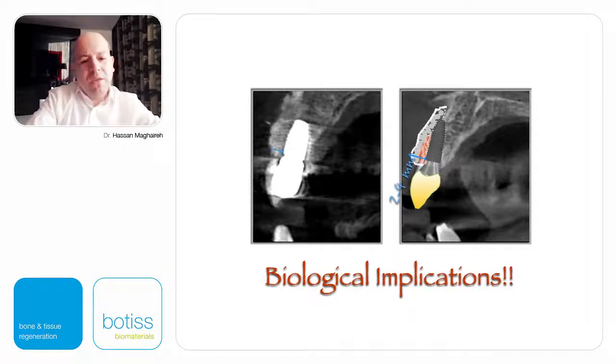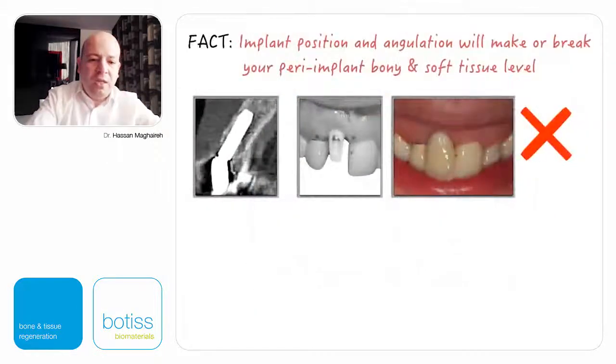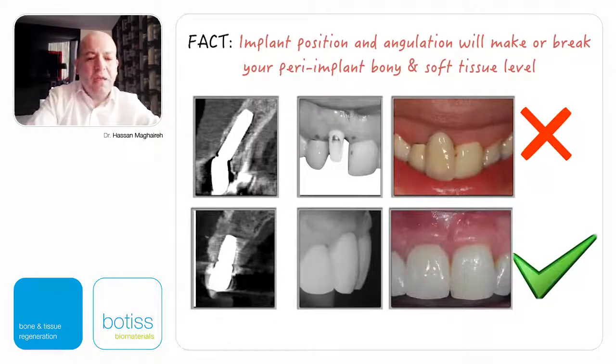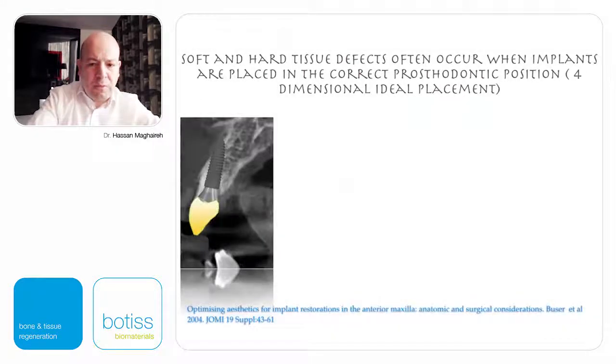And this is what we're talking about. When you look post-op, I still have my desired labial bone, guided bone regeneration, giving me the stability I want. Placing the implant in the wrong position will make it hard for the bone to stay, and will make it hard for the guided bone regeneration to work and give you correct results. In this case, you could compare the results here with another case where the implant was placed in the right position, guided bone regeneration was done easily, and there was no pressure within the prosthetic envelope for the implant, within the bony envelope for the guided bone regeneration, and we've got good, predictable, reliable long-term results.